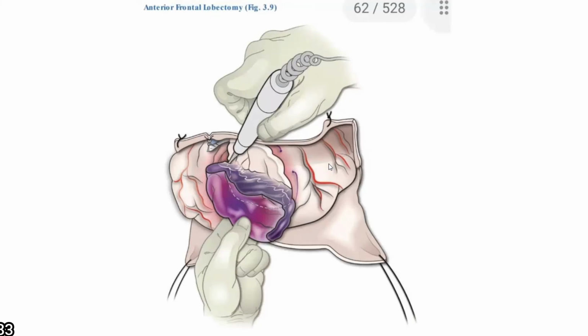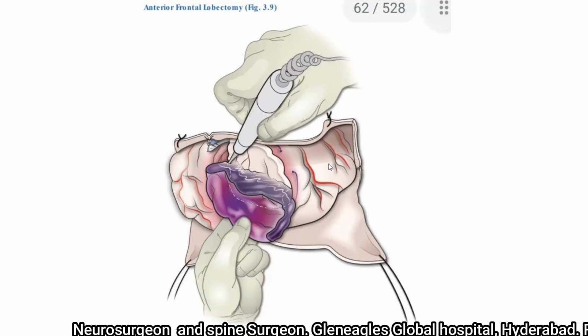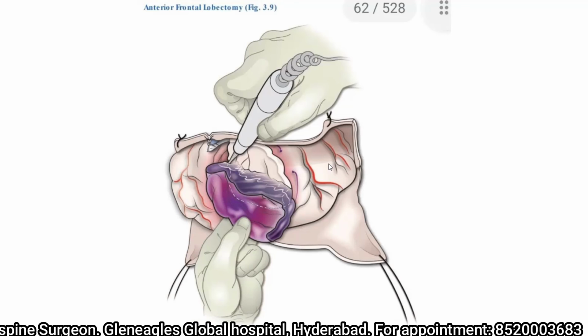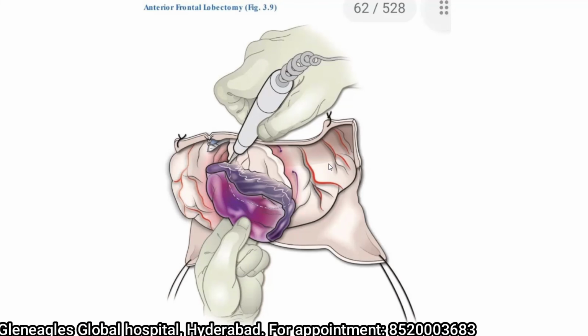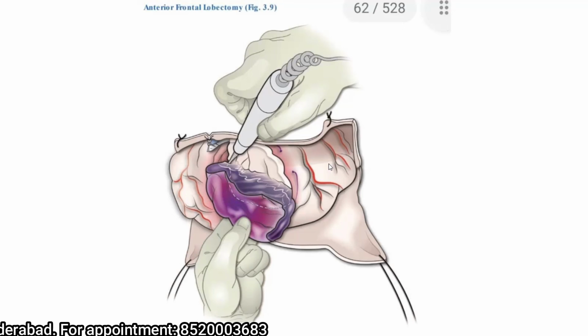So once I achieve the hemostasis, the next steps are similar to my previous session. You decide whether you want to do a primary duroplasty or an expansile duroplasty or just tack-up sutures augmented with Abgel. You decide whether you are going to replace the bone flap or preserve the bone flap elsewhere. Achieve hemostasis, place a closed suction drain and close the skin in layers.